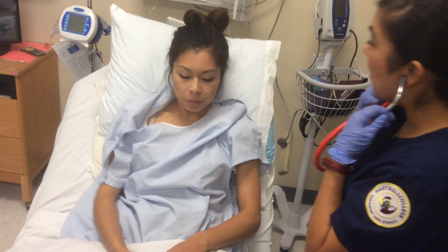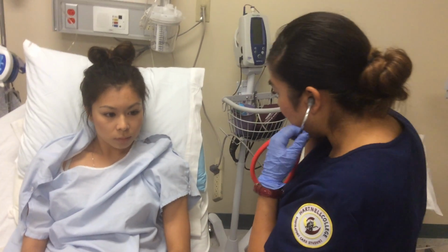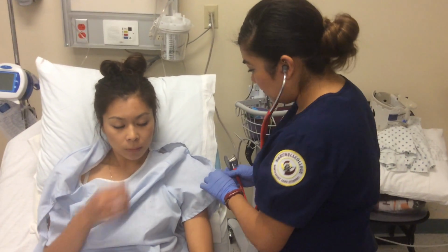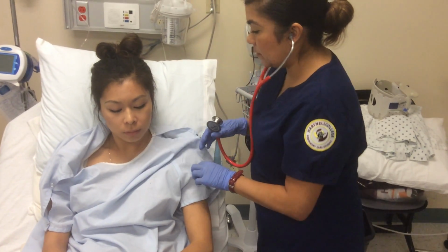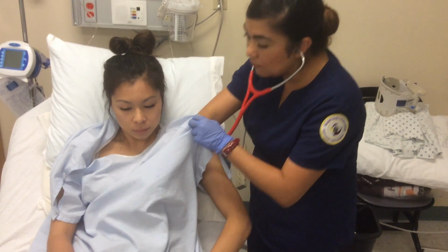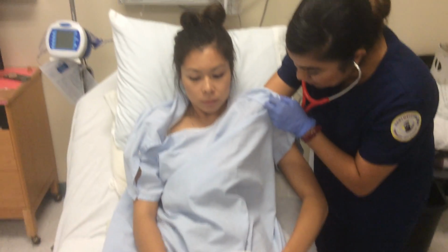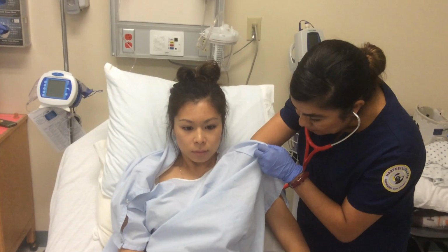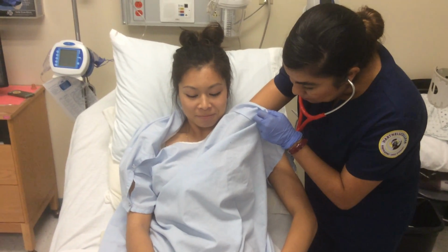Thank you. And again, I'm going to listen to the front. Okay, excuse me. I'm just going to sneak in here. Okay, go ahead. Very good.